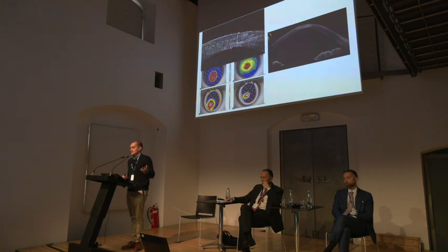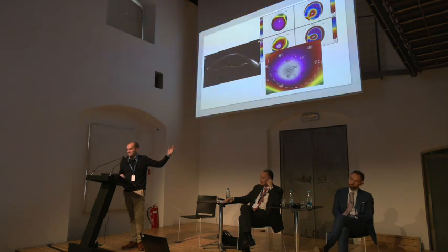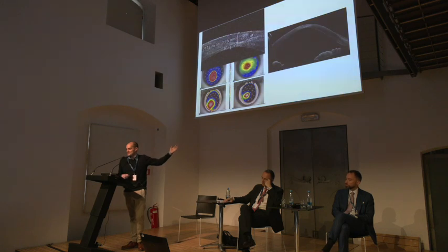You basically end up with a person who is waiting for a corneal transplant. You thought you had 356 in the center, you have 106. Tell him not to exert any pressure on himself and go get a transplant. That is why when you use Scheimpflug as your primary way of tracking keratoconus, again, this map and this eye are the same as this.